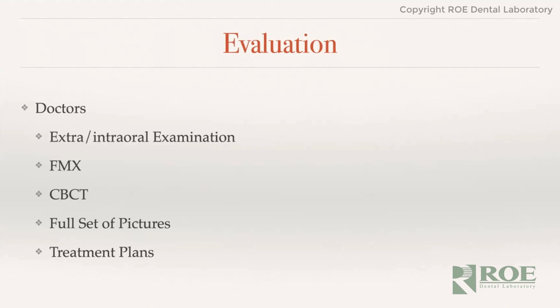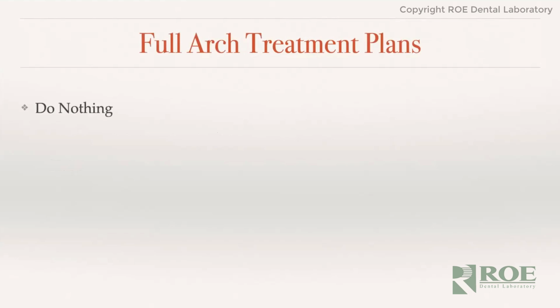The full set of pictures, it's our job to make sure that these pictures that we're taking, that we want to send to Road, we do this with all of our patients, with different aspects, that they're a good picture. No matter how much I try, my assistants sometimes have some issues taking clear pictures, and we do need to make sure that the pictures are what they need to be, so that the lab gets what they need, and also we're able to show nice before and afters. I'll show you some pictures later on that I wasn't paying enough attention to, and they looked good, and then when we blew them up with the computer, they weren't nearly as clear as we needed them to be. And obviously, we're the ones that have to be in there to give the treatment plan.